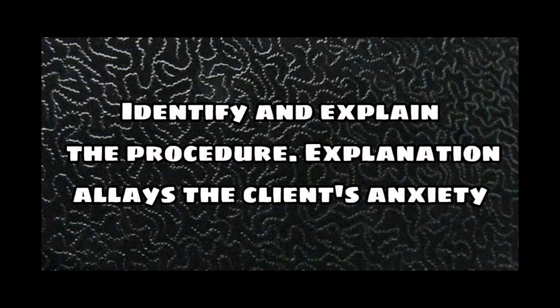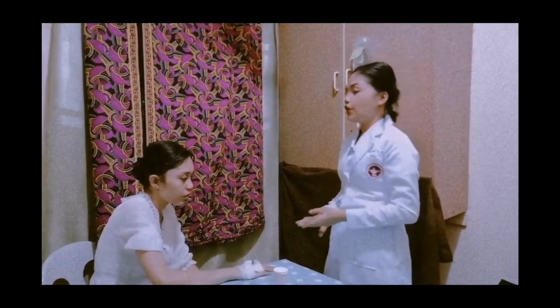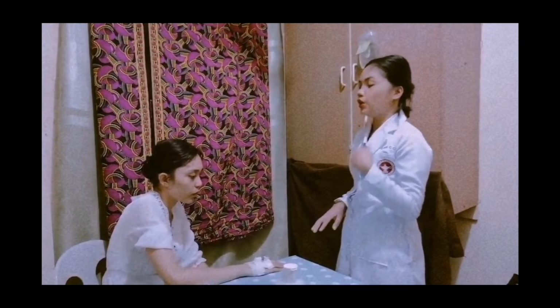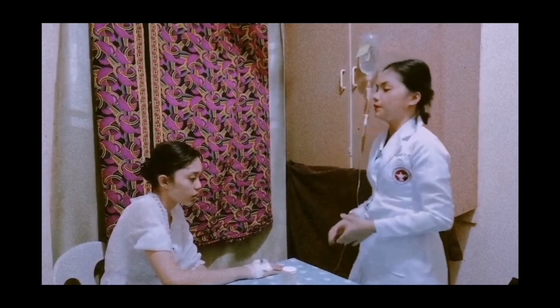Next is to identify and explain the procedure. Explanation allays the client's anxiety. So ma'am, based on your doctor's order, I am going to discontinue your IV infusion because you are ready to discharge and your condition is stable po.